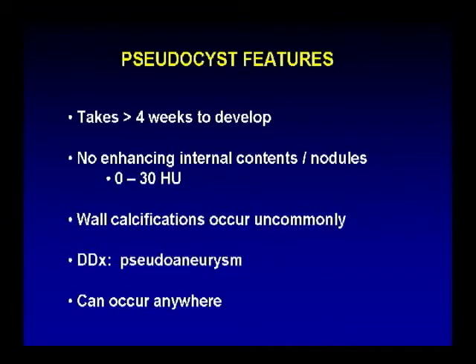In the setting of pancreatitis, the big differential is pseudoaneurysm, and obviously it's a real differential only when you have thrombosis of the pseudoaneurysm, so that it does not enhance following contrast.